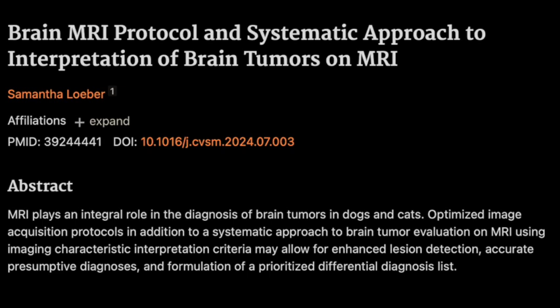Now, DWI, it's really good at showing us if something's changed in how water molecules move through tissues. And that diffusion, it changes when the tissue is damaged. Picture this. In healthy tissue, those water molecules, they're zipping around, no problem. But when it's damaged, say, after a stroke, it's like everything's jammed up, slows the water down. So like those molecules are trying to squeeze through a tight hallway instead of an open room. Exactly. And DWI, it lets us see these changes like we're looking through a microscope.